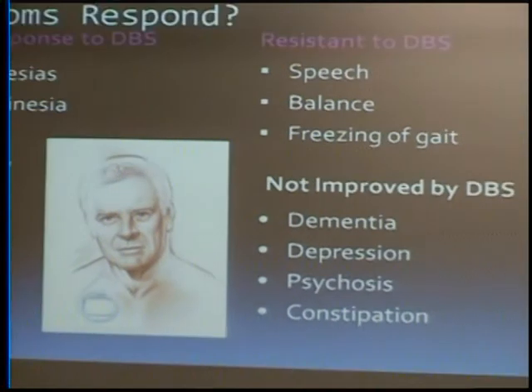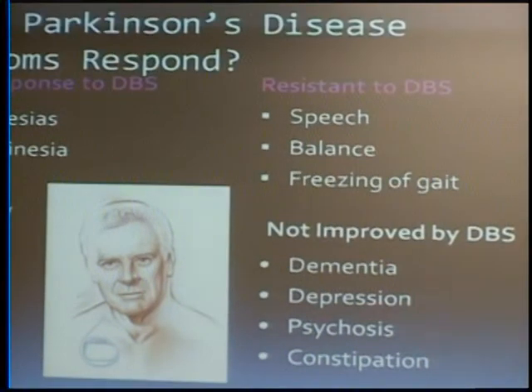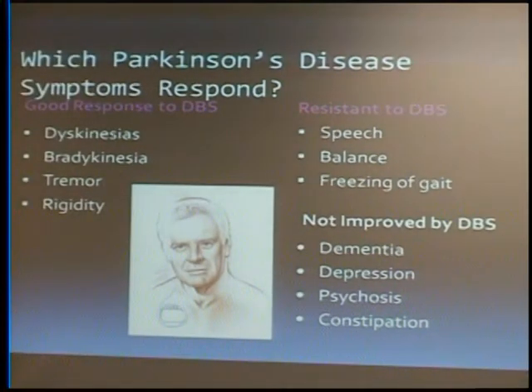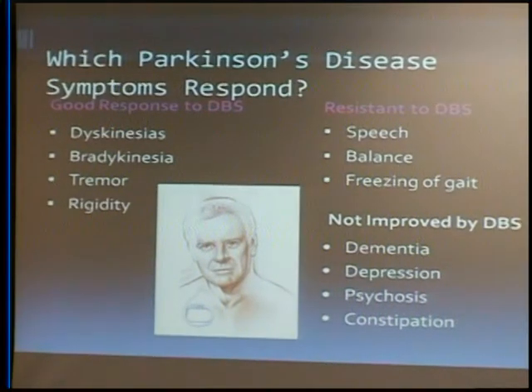Now, I don't think that really had to do with just the surgery of implanting the leads, but the fact that people were taking less Parkinson's medicines, their symptoms were under better control, they were able to be more active and have better quality of life. And I think for any of us, if that happens to us and we can function and do better in our day, we're of course going to be happier. So I think it was due to that. But directly, it's not meant to improve mood.